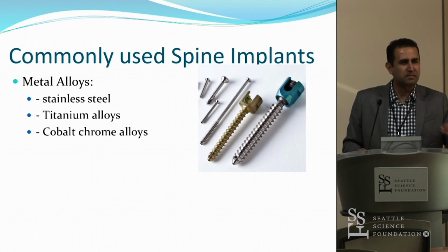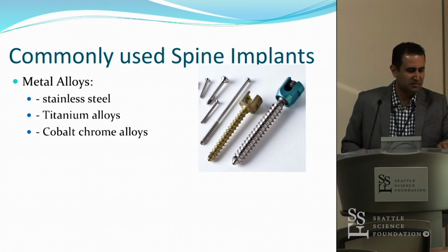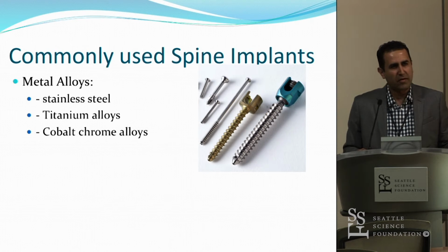That's used is carbon fiber. You know, they have carbon fiber implants in Switzerland that also are very good for proton beam therapy. They even have screws where the screw shafts are made of carbon fiber, and it's just the tulip heads that are made out of titanium. They're not FDA approved in the United States, but we're thinking about trying to get those in through compassionate use to have them permitted at our hospital.